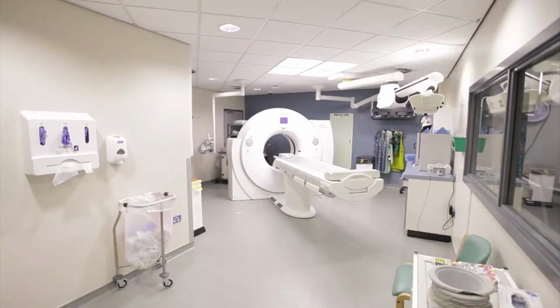For this exhibition we used a CT scanner to get pictures of some of the bones of the people. And to understand how a CT scanner works, it's useful just to understand how an X-ray is taken first. So with an X-ray, originally a photographic film was put behind the part of the patient being X-rayed. These days we would use an electronic digital detector, and the X-rays are shone through that part of the body, and that will blacken the film or be detected by the detector plate.